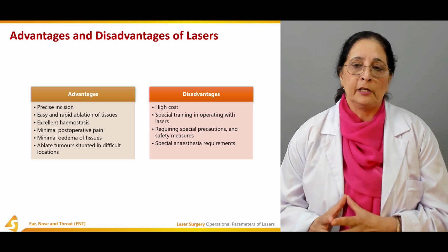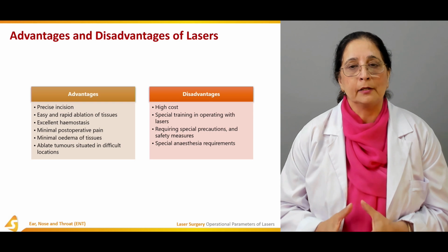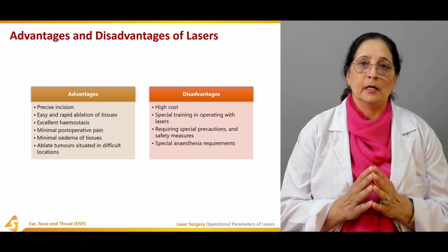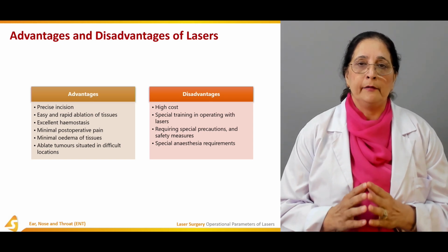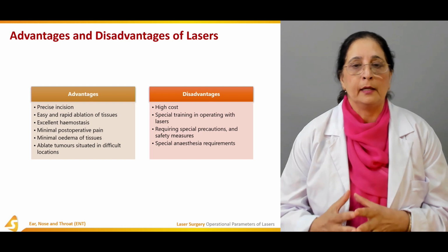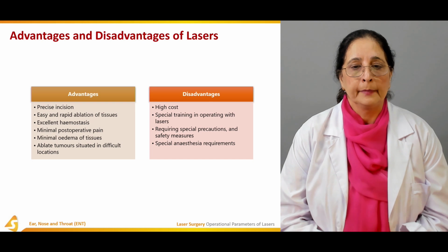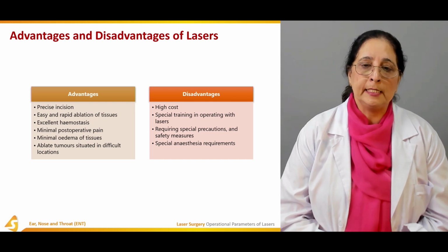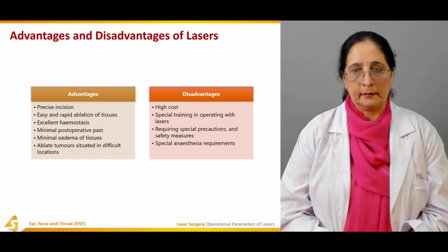The main disadvantages are the high cost and the special training required. Other than that, we need a smaller operation area and smaller access area. It can access areas which are not accessible by other ways, and there is rapid, excellent hemostasis, minimum injury, and minimum edema. So all these are the advantages of the laser therapy.